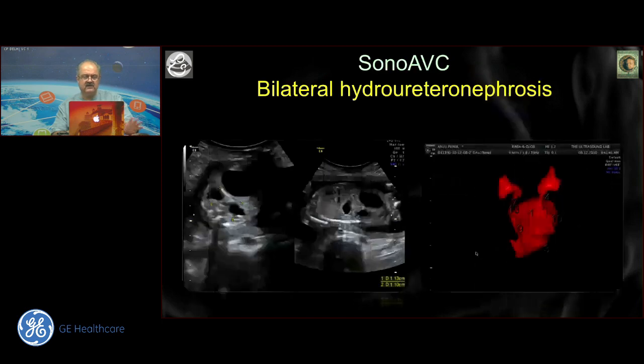You just take a clean sweep. Again, you suspect that of course these must be bad kidneys. There's a shaggy cortex which is thinned out, and 2 spaces here at the back of the fetus, and there's a bladder almost coming up, and then you try and do it and you say, yes, of course. There's an inversion and then a color assignment that is a part of the software. You just press a single button, and you realize that there are very, very short ureters, bilateral hydronephrosis, and a hugely enlarged urinary bladder, about 10 times as large as each of the kidneys.